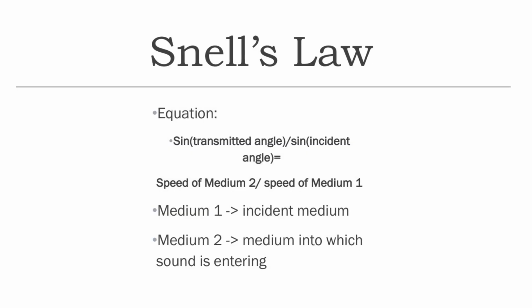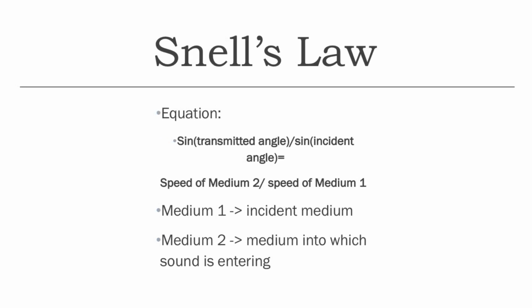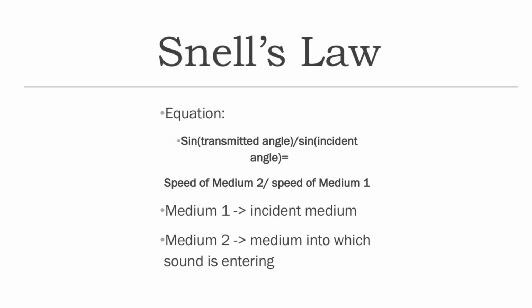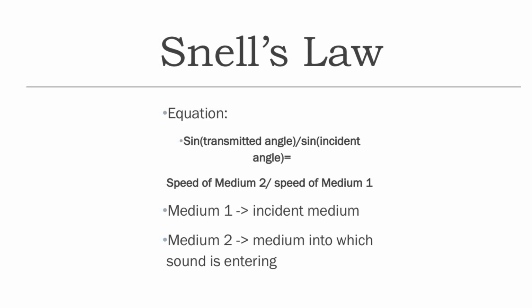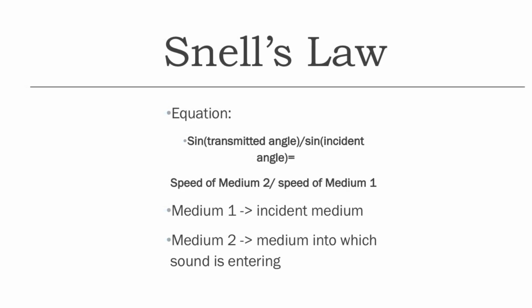Snell's law lets us predict the direction of the refracted sound. It states that the magnitude of the refraction is directly proportional to the angle of incidence and the difference in velocity of the sound waves within the two tissue types. Snell's law describes the relationship between the angles and the velocities of the waves. The characteristics of each media impacts the direction of the refraction.